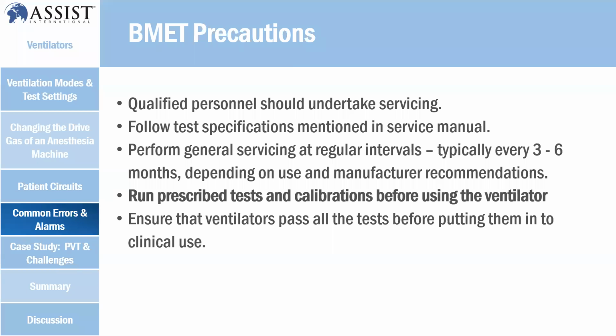And always run a self-test and calibration before using the ventilator for further testing. Ensure the ventilator passes all the tests, and once everything is good and all testing is passed, only then can you pass it to the clinical user to use. Until then, don't put it into service.